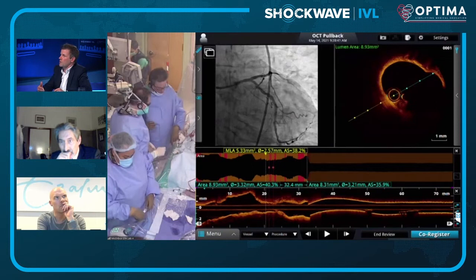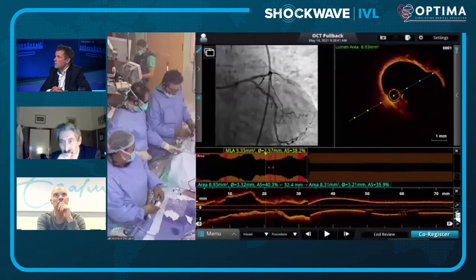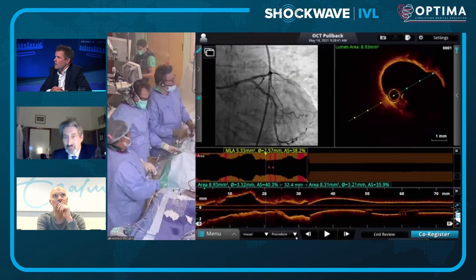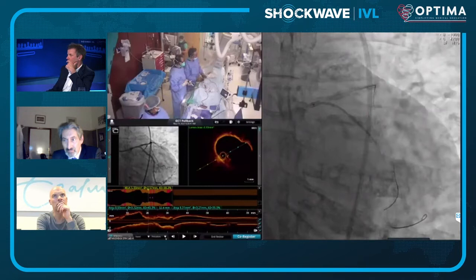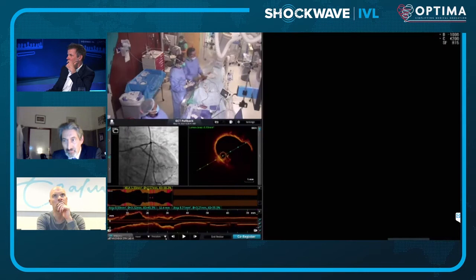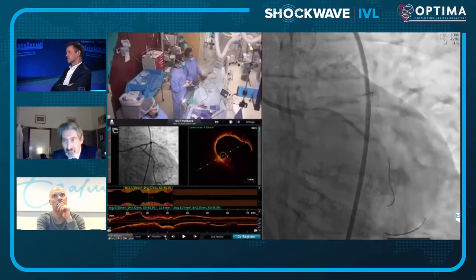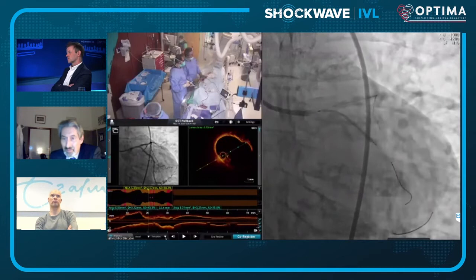Richard addresses measurement differences with saline versus contrast OCT: a study by Ziad-ul-Haq Lee and his son Evan showed no tremendous clinically significant difference in vessel sizing. If anything, saline slightly undersizes, meaning you won't oversize a stent — important for safety. He plans the proximal landing zone to allow about 8 mm for POT at the ostium.